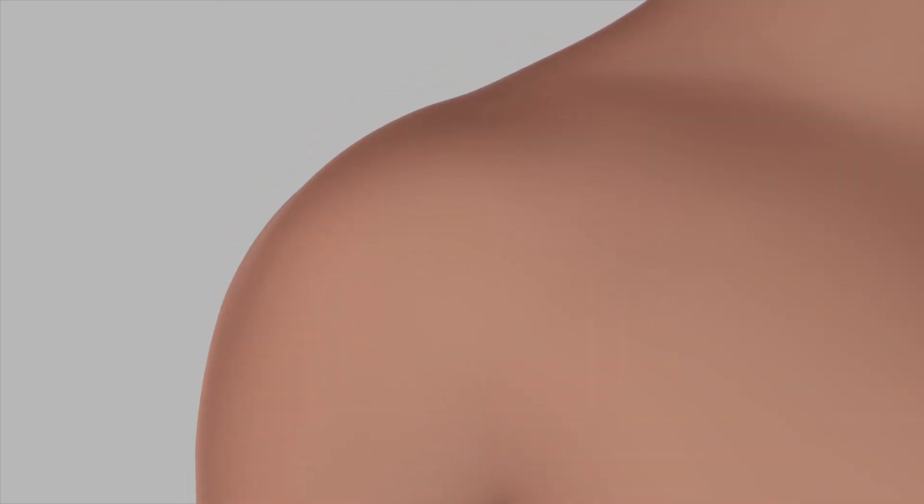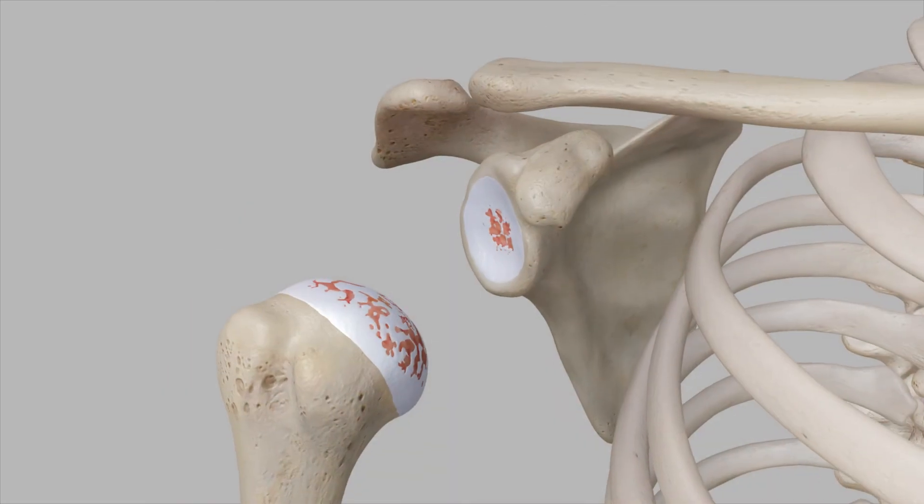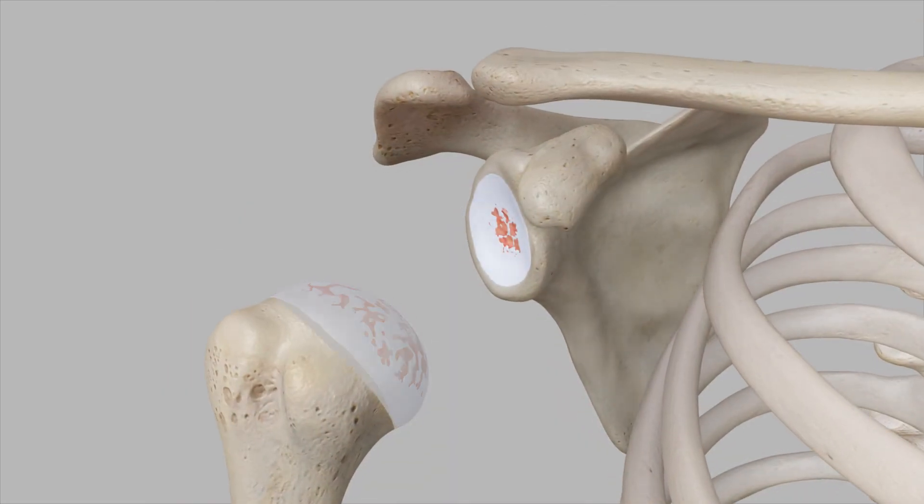The surgeon will make an incision in the front of the shoulder, long enough to see and access the joint. Once the shoulder joint is exposed, the head of the humerus is removed. Next, the socket (glenoid) is cleaned out and prepared for the implant.